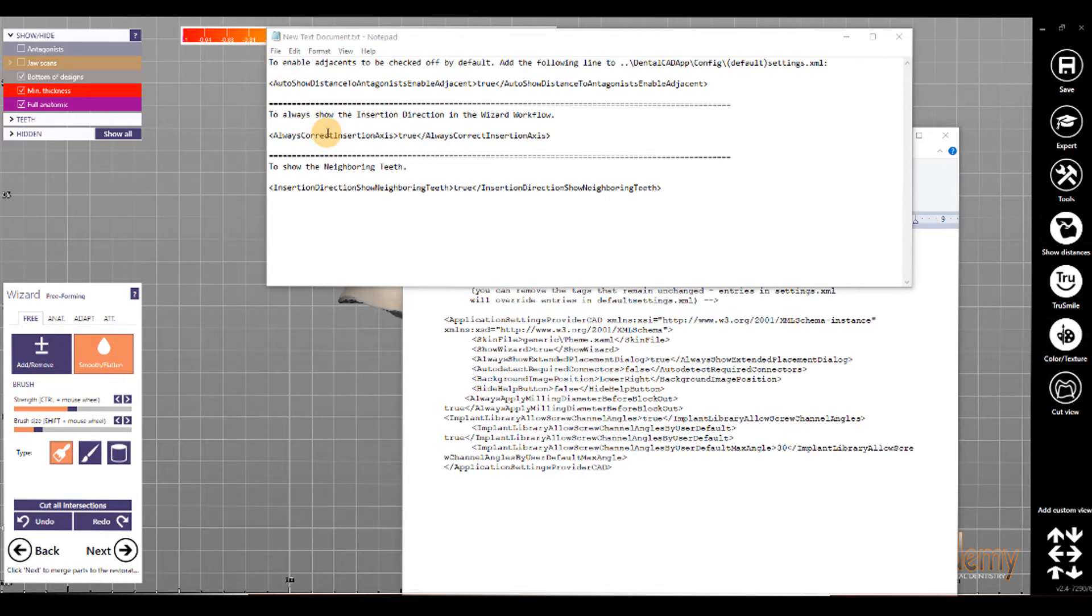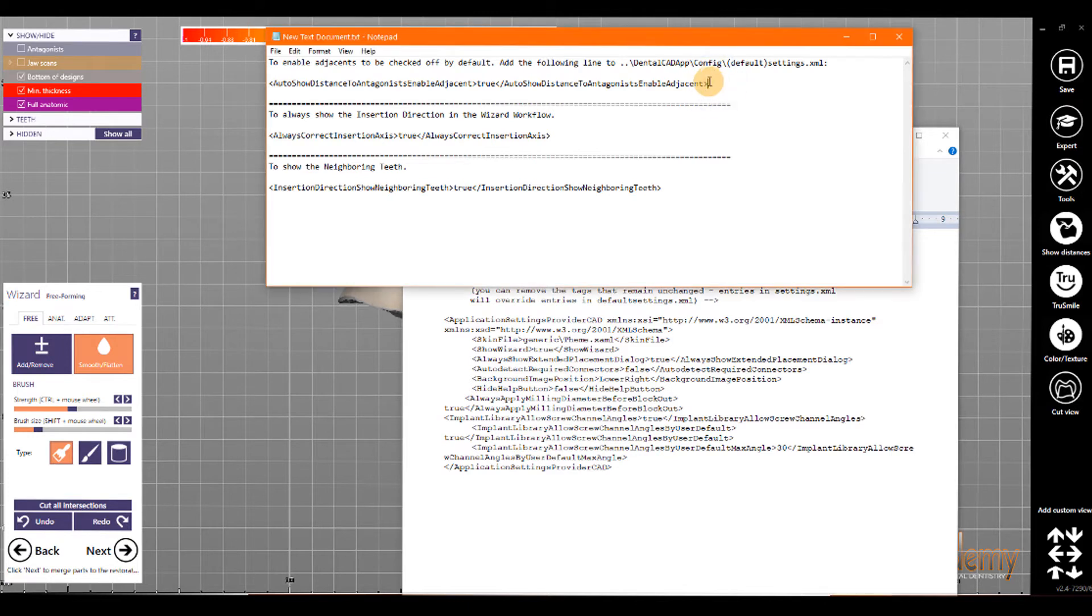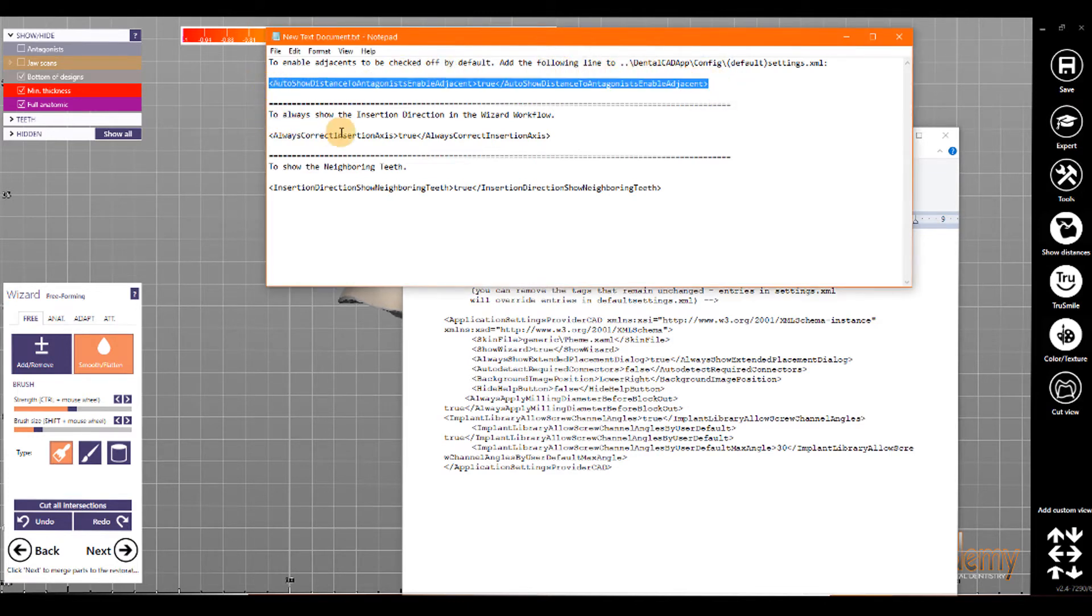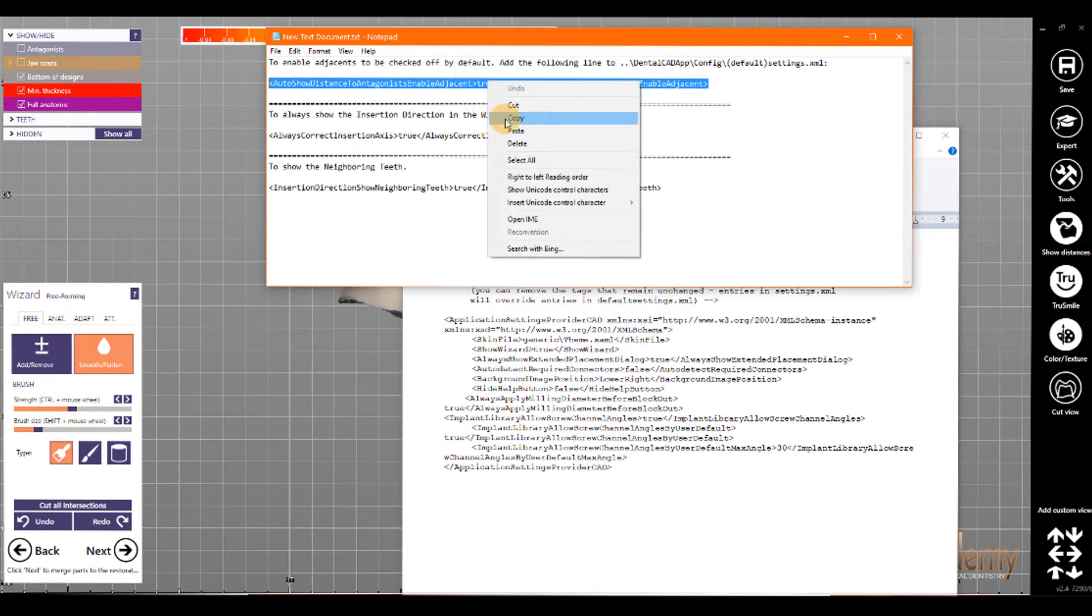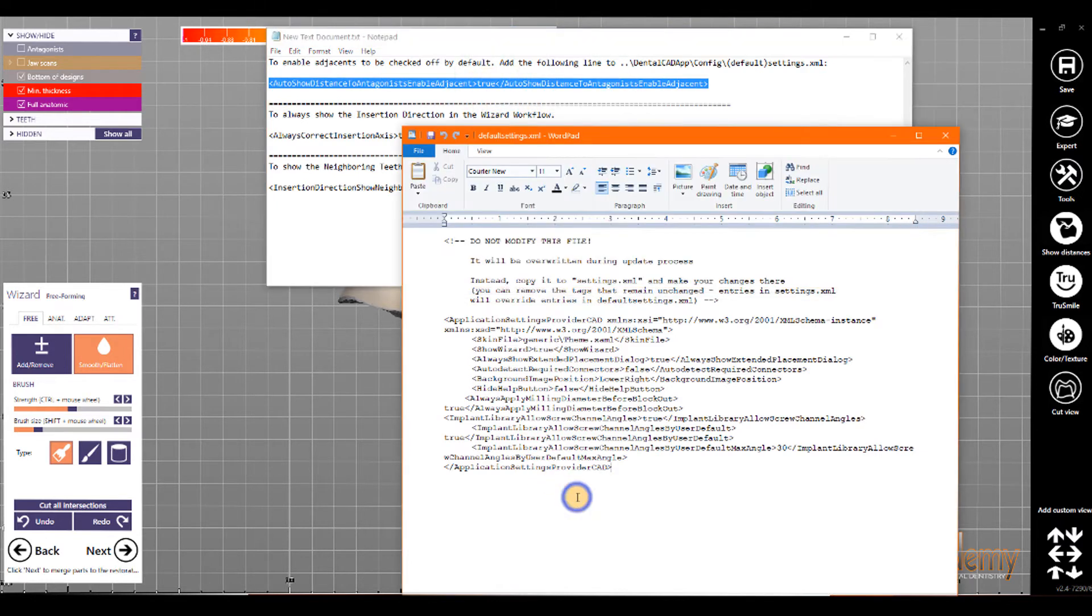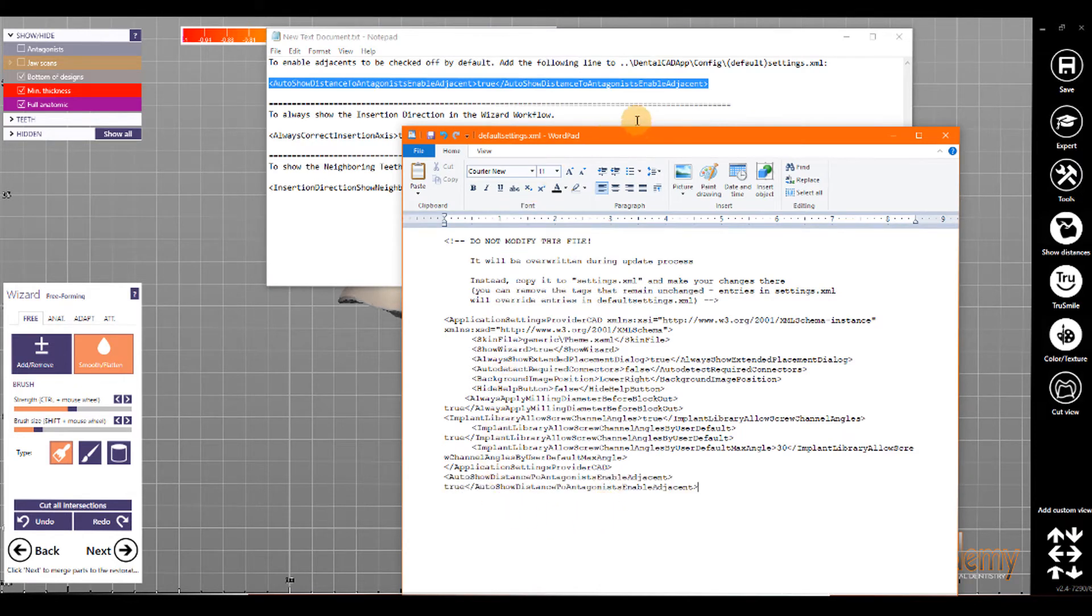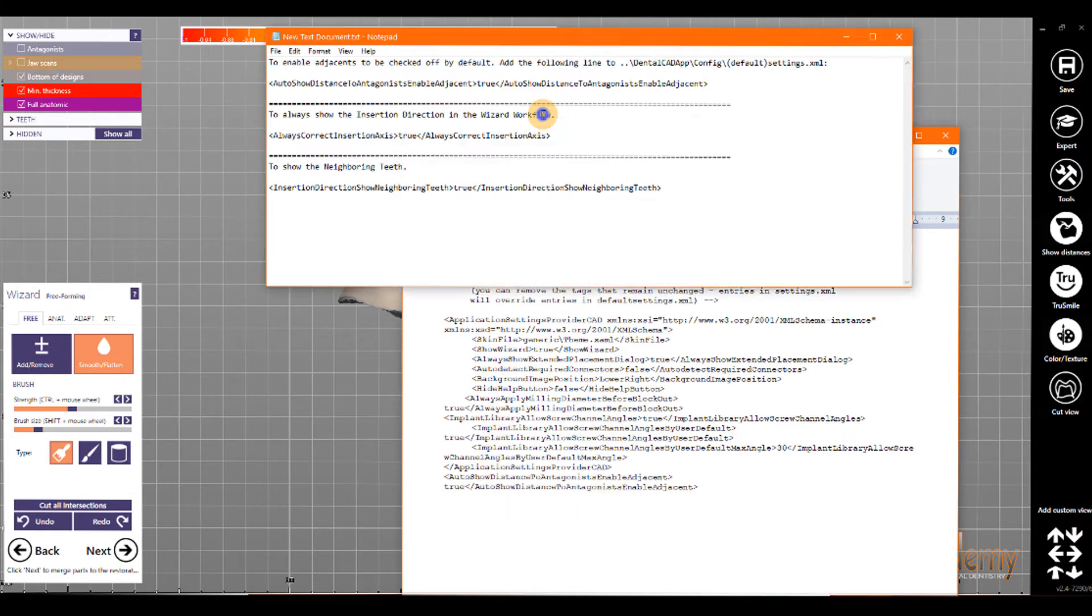To enable the adjacents to be checked by default, we want to add this XML tag, auto show distance to antagonist enabled adjacent, and we want to make that value true. So, I'm going to copy that, and then I'm going to paste it in our XML file.